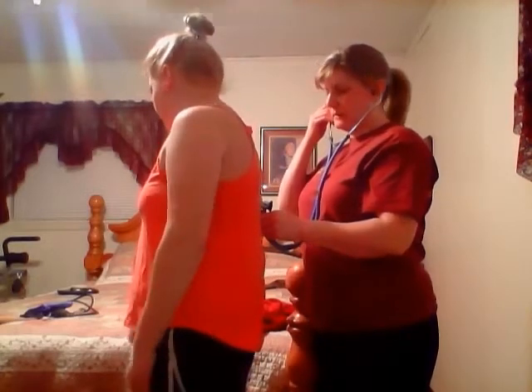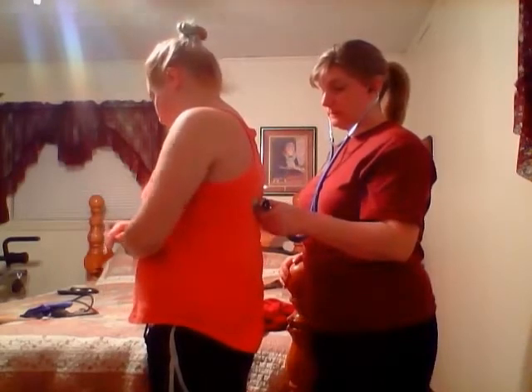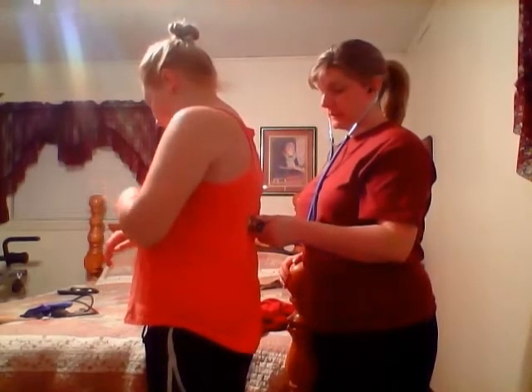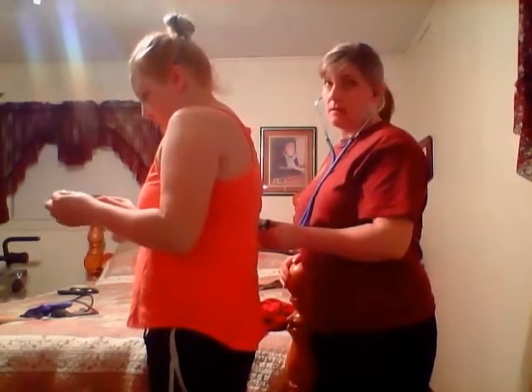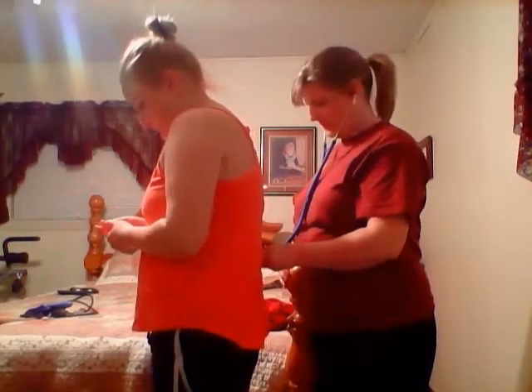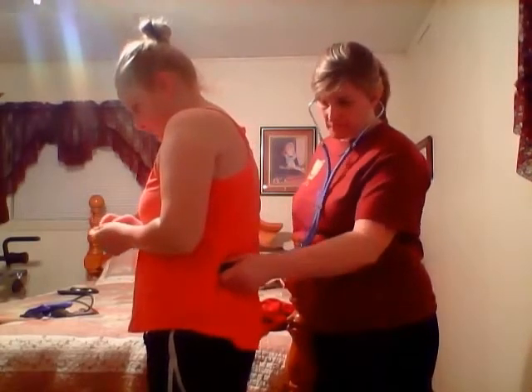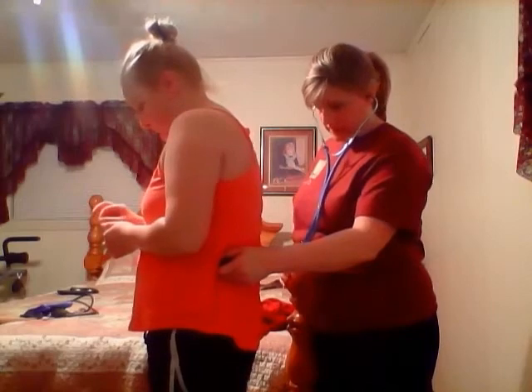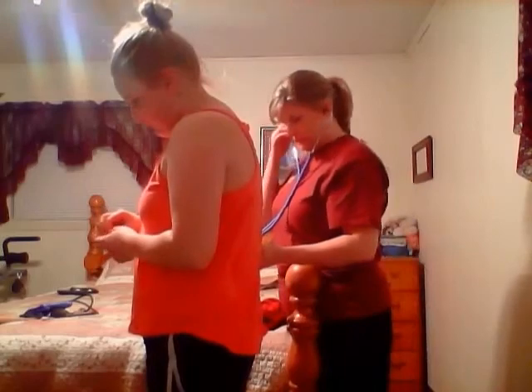Of course, as you get lower down in the lungs, you'd want to encourage the patient to breathe just a little deeper. Okay, take a nice deep breath for me. Good. And again. Good. You kind of want to walk it down to the outside of the ribs. Just make sure they're getting into those lower lobes. Nice deep breath. And again. Good.